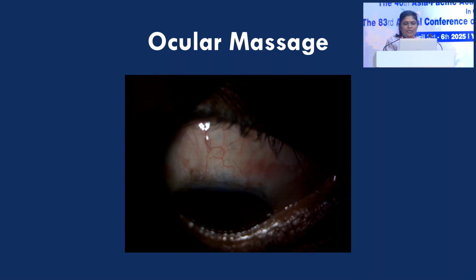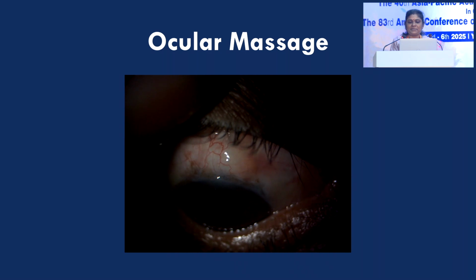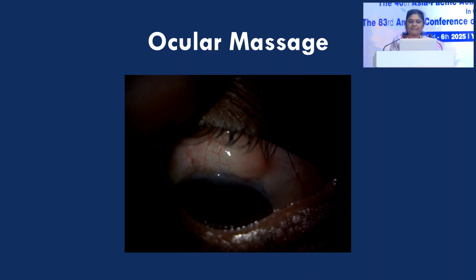So this is a small video demonstrating the digital massage. You can see there is a flat bleb. As I just pressed behind the scleral flap, you can see the bleb is getting beautifully elevated.